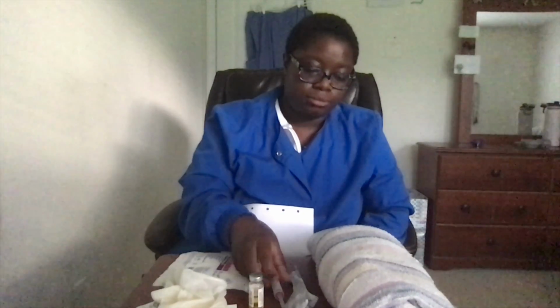0.5 milliliter of fluid. And you see the plunger is at the 0.5 milliliter mark. The tip of the plunger, mind you. And it says once. And this is flu vaccine season for the flu, so this is appropriate. And this has been signed off by Dr. Smukta. So we're okay. Okay? All right.